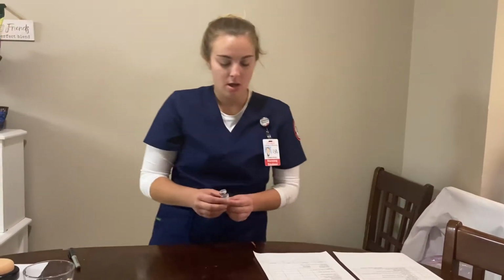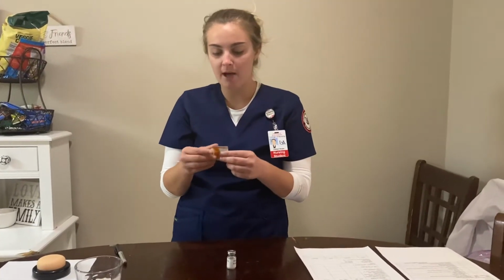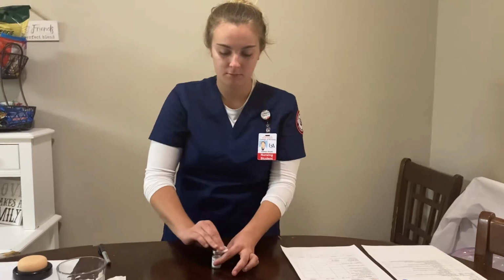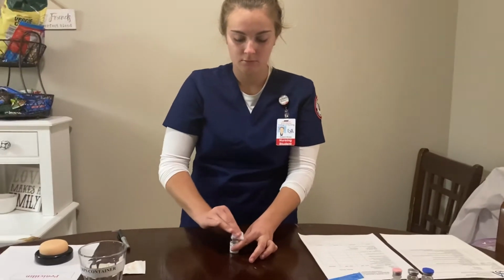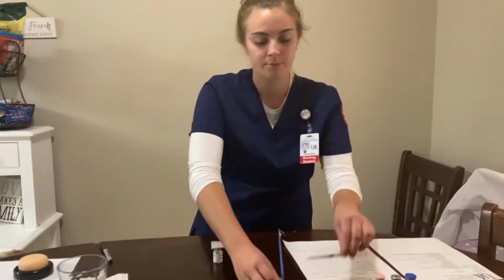So if I have 10,000 units for every milliliter of heparin, and we're giving 5,000 units, then I'm going to put 0.5 milliliters in my syringe for the medication I'm going to give. So the dosage would be 0.5 milliliters. I'm then going to clean off my vial with an alcohol pad. And then grab my TB syringe.